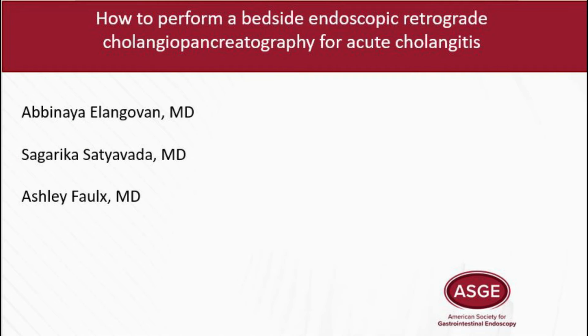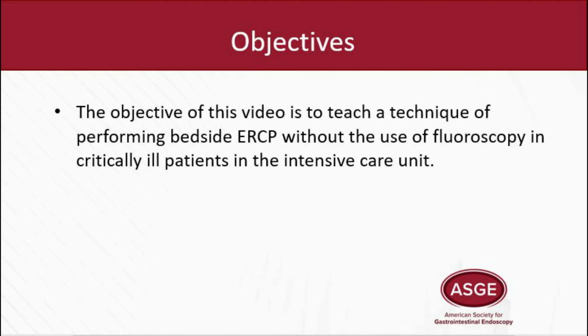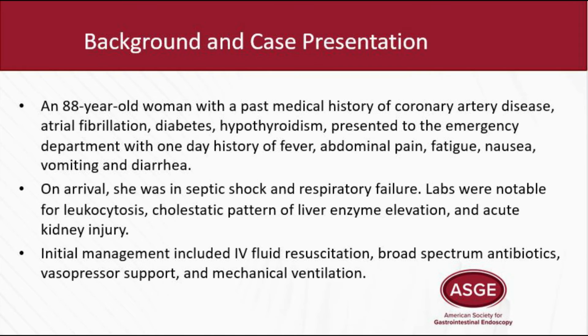How to perform a bedside endoscopic retrograde cholangiopancreatography for acute cholangitis. These are our disclosures. The objective of this video is to teach a technique of performing bedside ERCP without the use of fluoroscopy in critically ill patients in the intensive care unit.